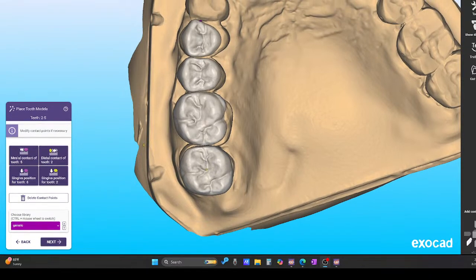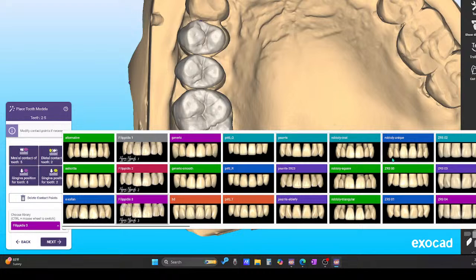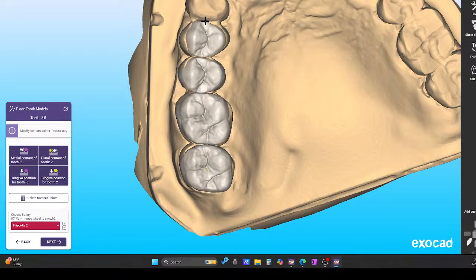Okay, so right here, the small little dot in the bottom, this is gonna let you just switch through instead of going through clicking one by one by one by one. You don't want to do that. Just leave it right there, and then just use the drop down little arrow keys over here, up and down, and see which one kind of covers most of the teeth. Again, this is just a wax up, so it doesn't need to be perfect.